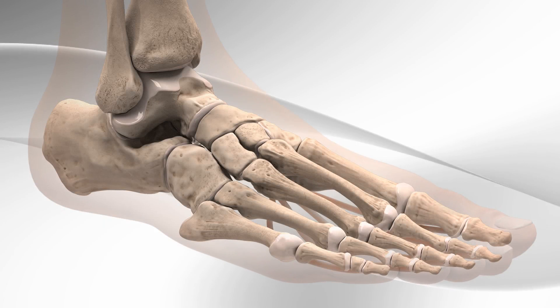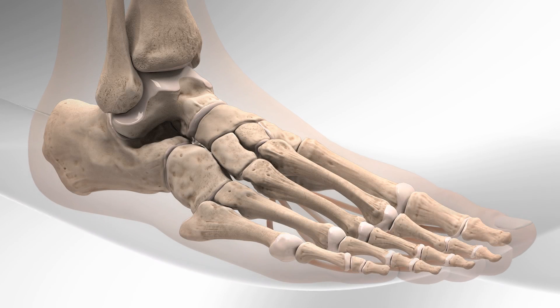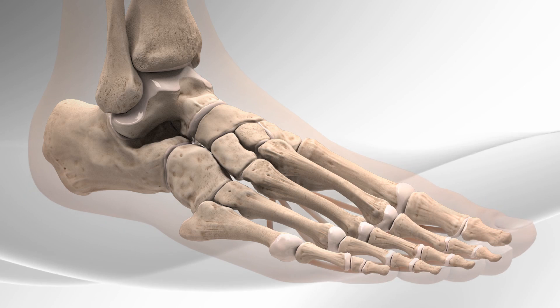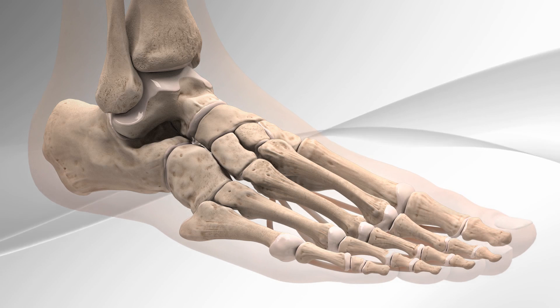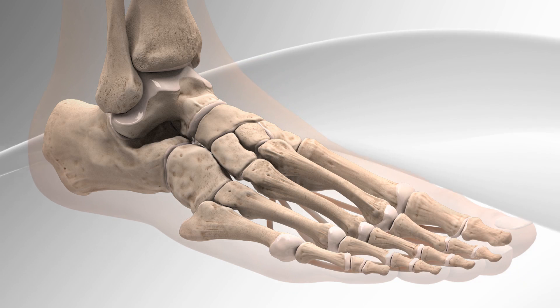The Arthrex Internal Brace Spring Ligament Augmentation Repair is a surgery for people who have flat foot due to weakness or rupture of the spring ligament or posterior tibial tendon. The spring ligament is the connecting tissue located under the foot that connects the calcaneus and navicular bone. This ligament is often repaired in people who have a condition called flat foot.